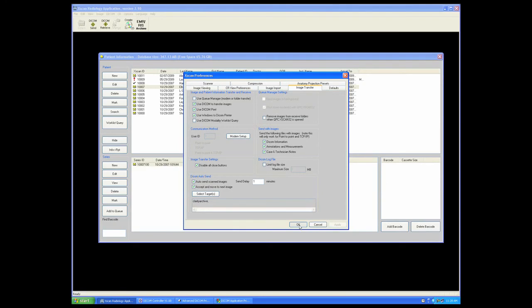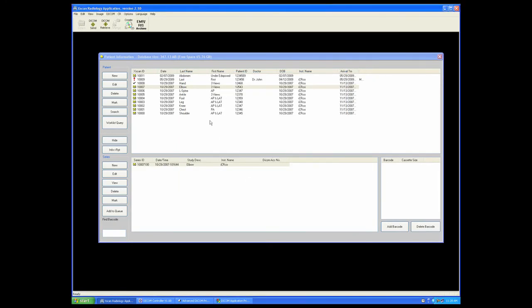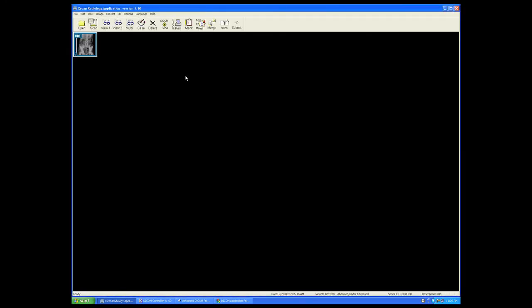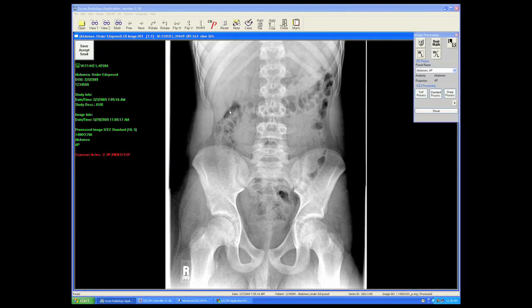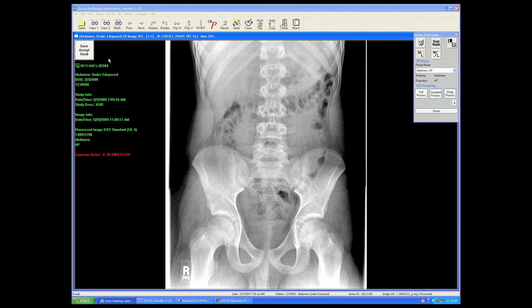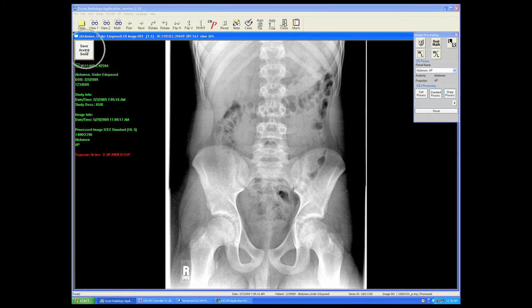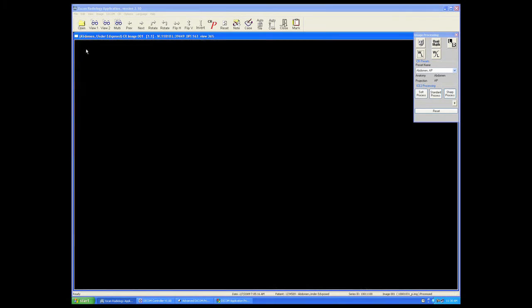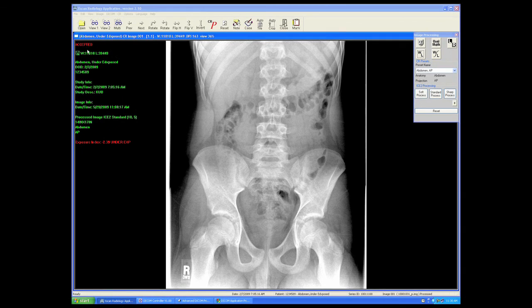When we go to open an image, you will note that the save and accept button now reads save, accept, send, and will accomplish an automatic send to the DICOM target when that button is depressed.